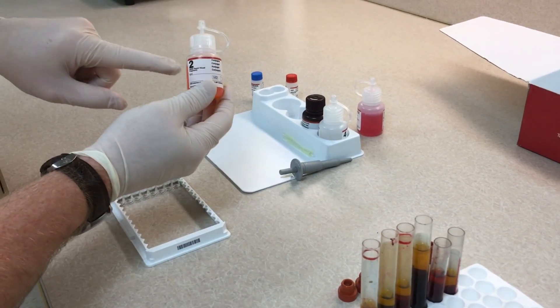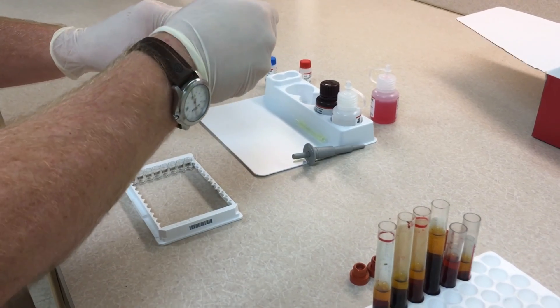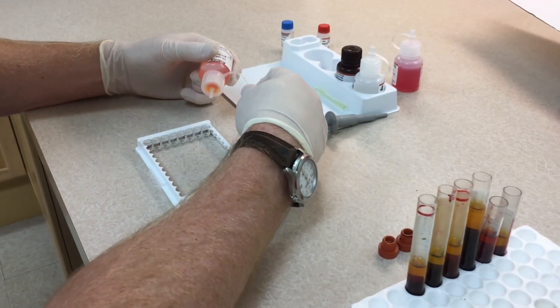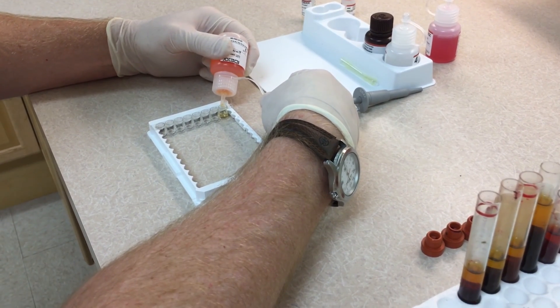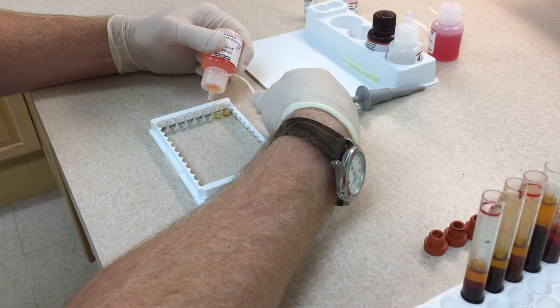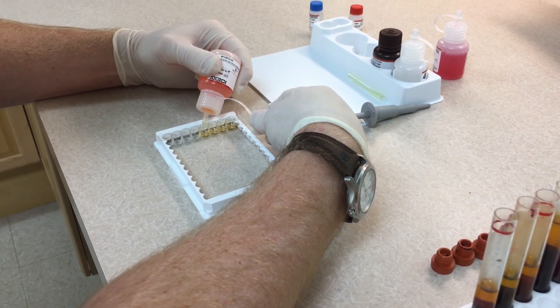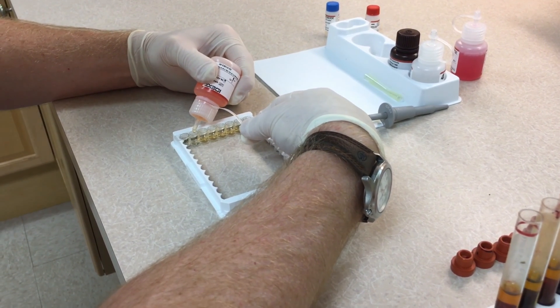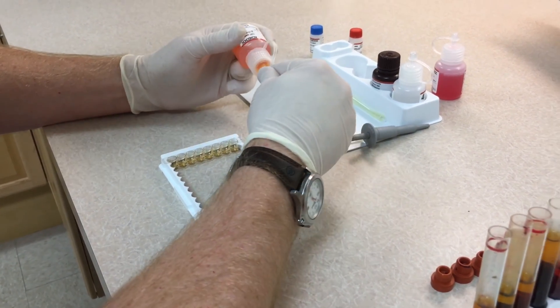Now use the second reagent — the conjugate reagent — open it up and put three drops into each well: three drops in the positive control, three drops in the negative control, and three drops in each of the six sample wells. Then set your timer for seven minutes again.